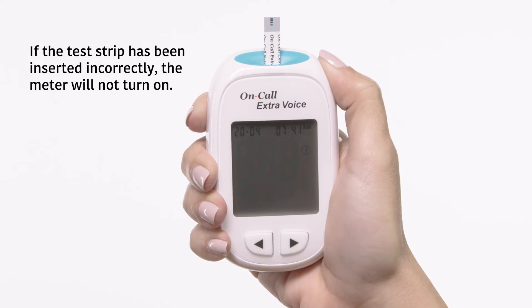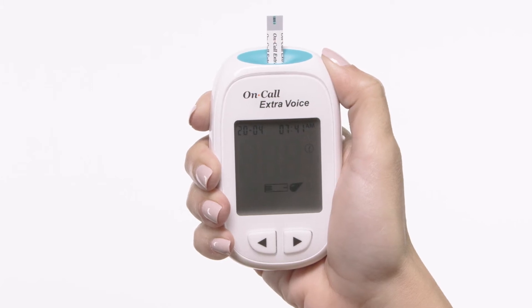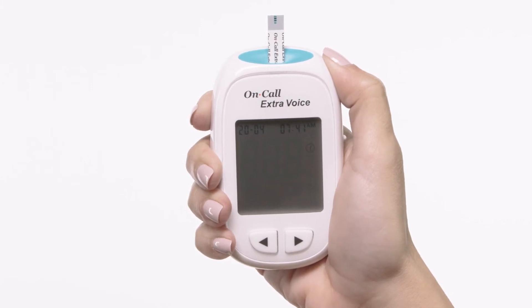the system will enter the test mode. The display will show the date and time and the strip icon with the blood sample icon blinking, to indicate that the test strip is inserted correctly and a drop of blood can be added.